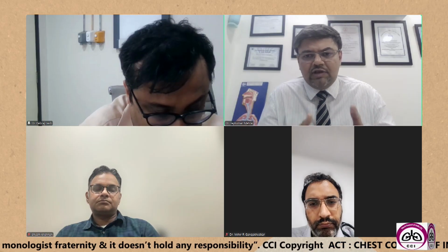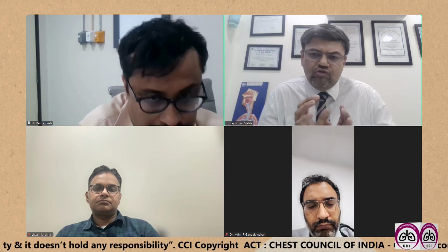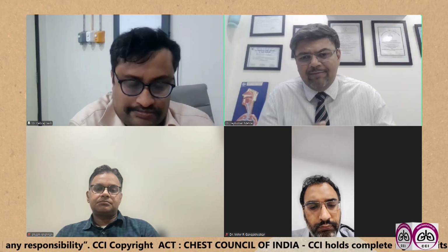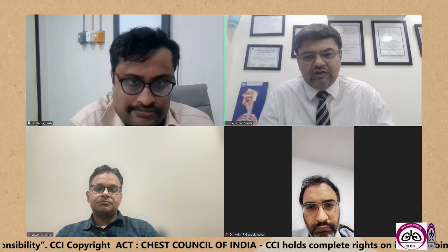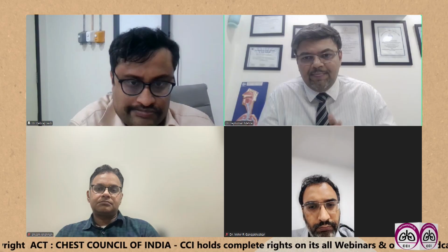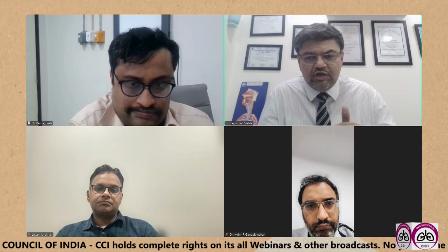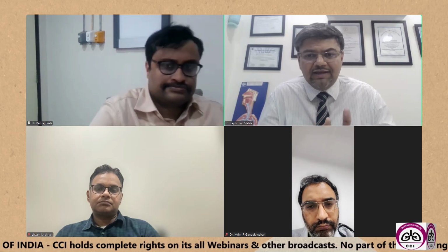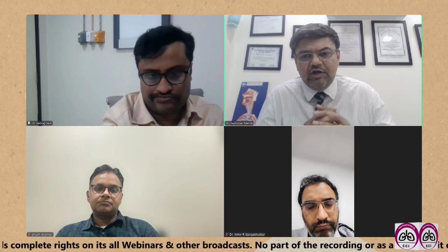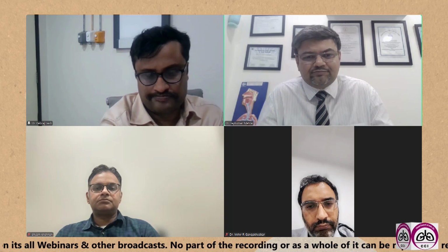In private practice like ours, I usually prefer, as Dr. Sham sir told, a calm patient who is well sedated, having an LMA, so that we can take good chunks, give a good yield, and the procedure does not have to be repeated. Sir, although this procedure can be done under deep sedation, and sometimes in borderline cases even under conscious sedation, I prefer to do the procedure under LMA for the sake of the best yield for my patients, sir.